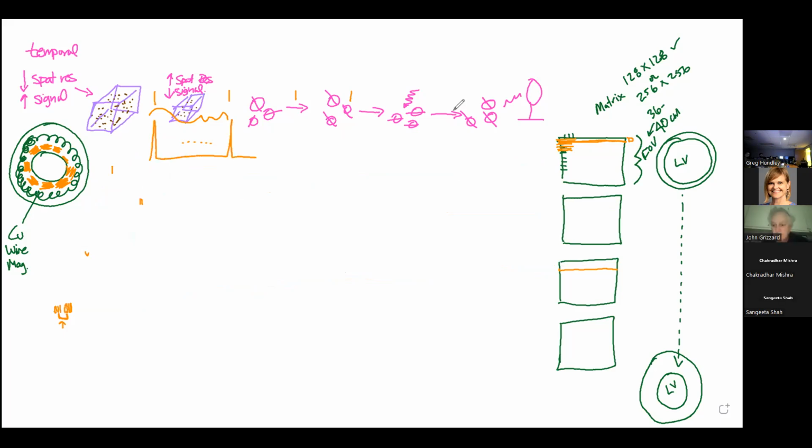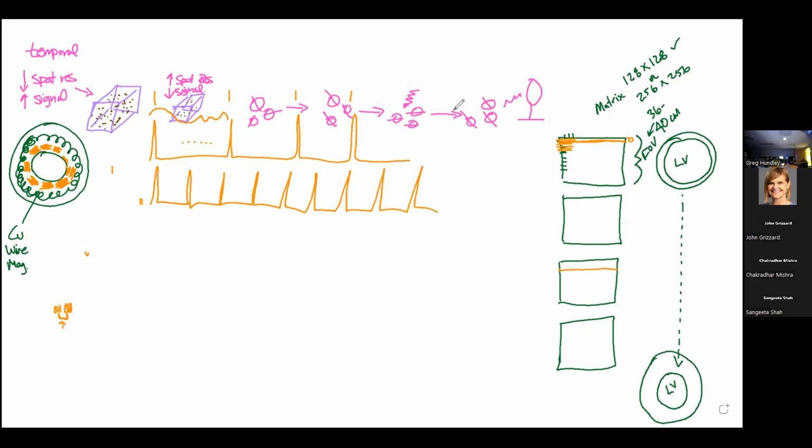Here is our original QRS. All right, now we're going to throw some issues at us, because in cardiovascular medicine, not everybody has a heart rate of 60 beats per minute. So the first thing we've got to deal with is what happens if the heart rate is faster. Okay, so now we're at 120 beats per minute. Let's pick 140. You can have 200, it doesn't matter.